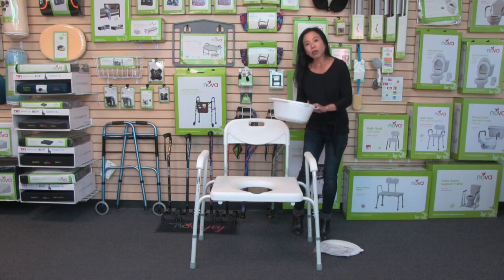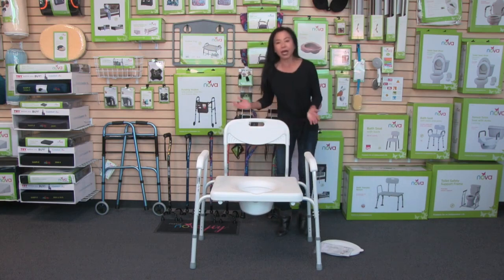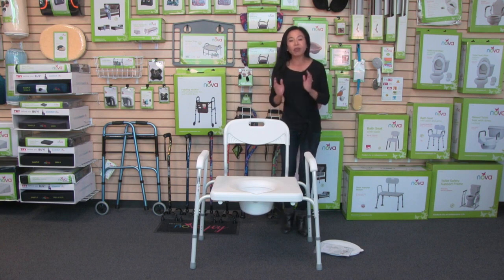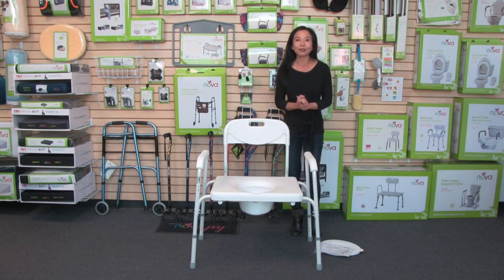To install the bucket, you just slide it in through the back, and now it's in place. That is the heavy-duty bedside commode, and as with all of our products, it comes with our care, use, and contact information, and how to reach us anytime.